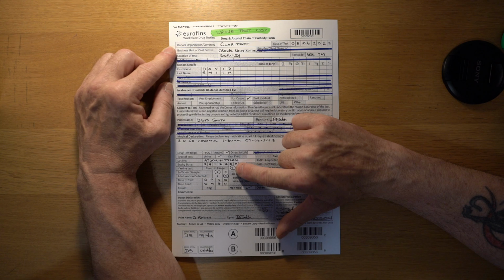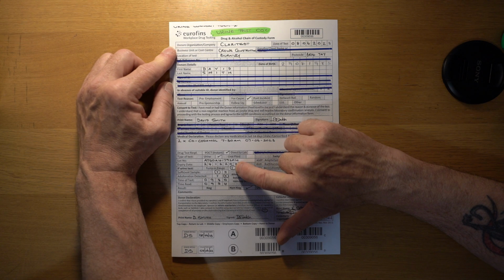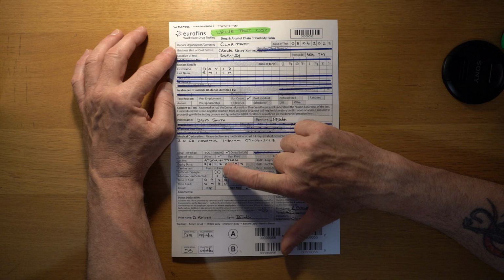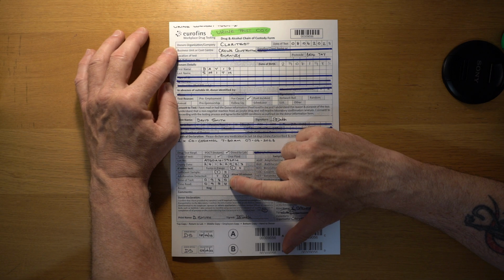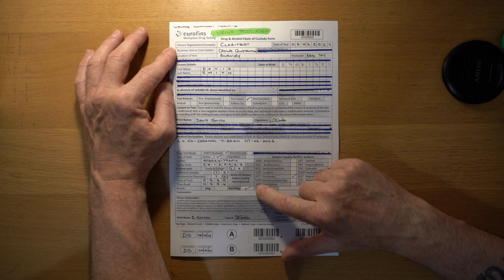Was the urine test within range? And I've circled yes, it was between 32 and 38. Was there sufficient sample? Had the person urinate up to the minimum fill volume line that we discussed? Adulteration detected. So as long as there's no adulteration detected, you circle the box there as no. Time of test was 9:30, and I read the test at 9:34. And then you'll need to say whether there's a negative or non-negative result.